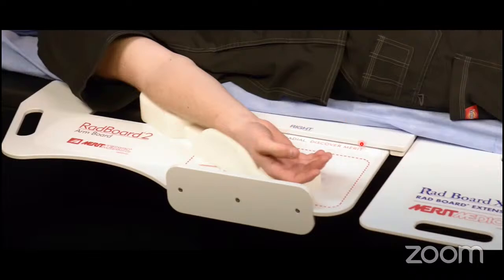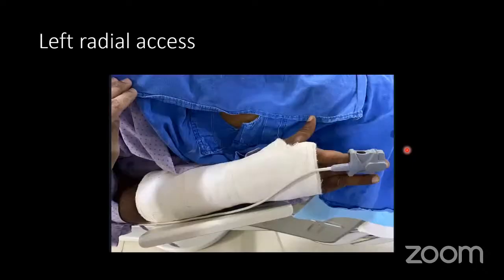But the thing is, if the upper limb is more near to the patient, we will be more comfortable with the long catheters and wires towards our right side. And after accessing, for taking the angio of the hand, we can rotate the table 5 to 10 degrees towards our side to bring the elbow into view.